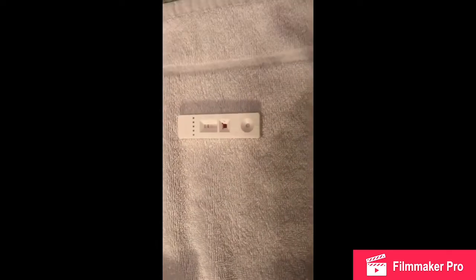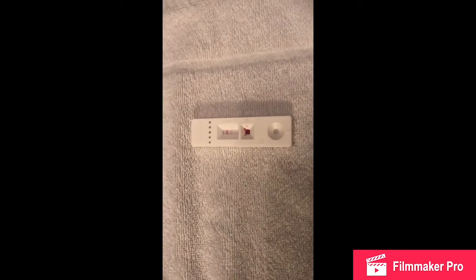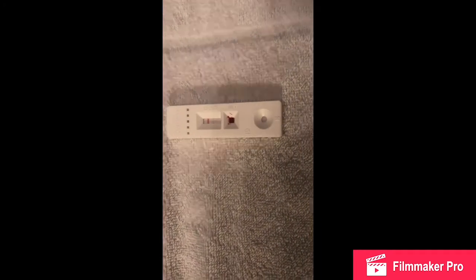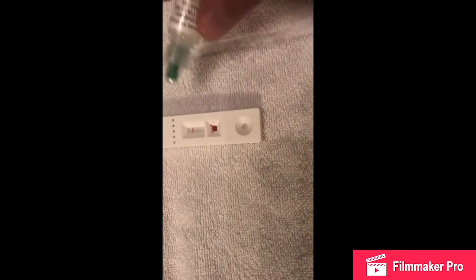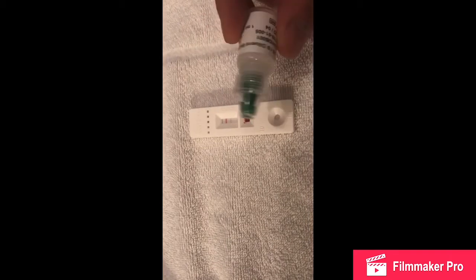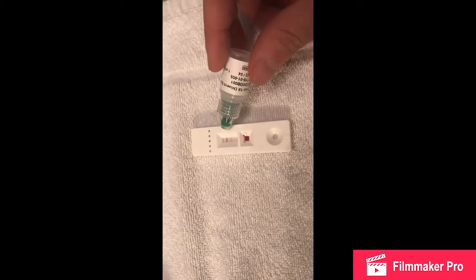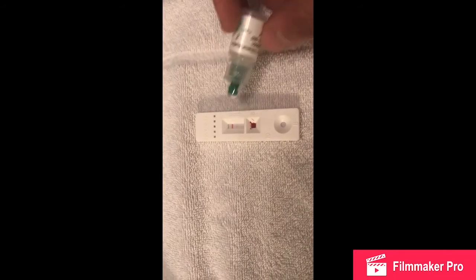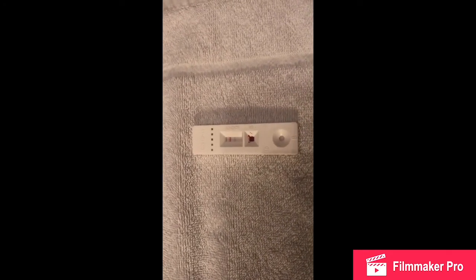Hello everyone. So these are the results — we waited 10 minutes. We had to make sure there was enough blood in box S, as you can see, and enough of this liquid — two drops. The whole point was that the top line needed to turn red, and if it was still blue you had to add more liquid to get the results correctly. The line has now gone red as the instructions instruct.